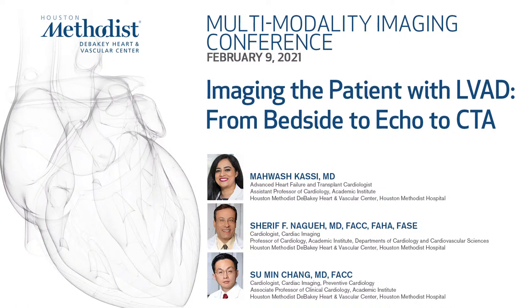What do you think? I think over 1.5 should be considered slightly elevated. Yeah, there were some studies which showed that correlation, but to be honest, clinically, I feel like we cannot really translate. There's a lot of published data on LVAD. What really needs to happen is you have to correlate what you find on echo with CT scan, whether those things are meaningful or not. As far as the Nyquist limit for color Doppler, the paradigm in our lab stays the same. We acquire like we do for other patients. Whether we should be adjusting the Nyquist limit for this patient is still an unanswered question. I don't think anybody's answered that question.